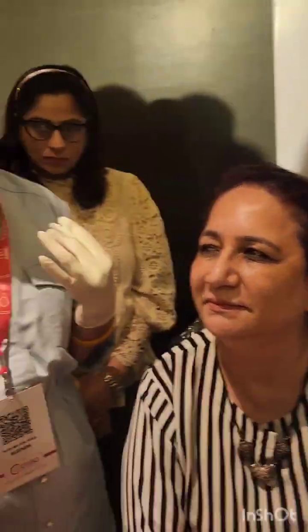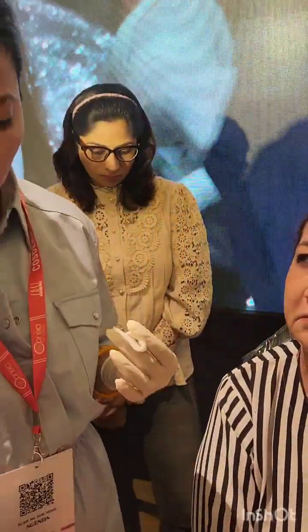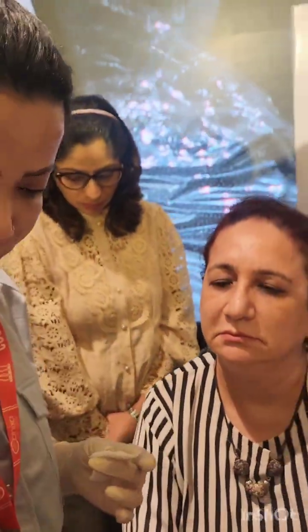So you know dominant face theory. So dominant face theory is the side you sleep is more saggy than the other, because that is pressed for a longer period of time. So let me come to the center so that we can try to. You want to correct this one? We'll correct that. This one is more sagged.